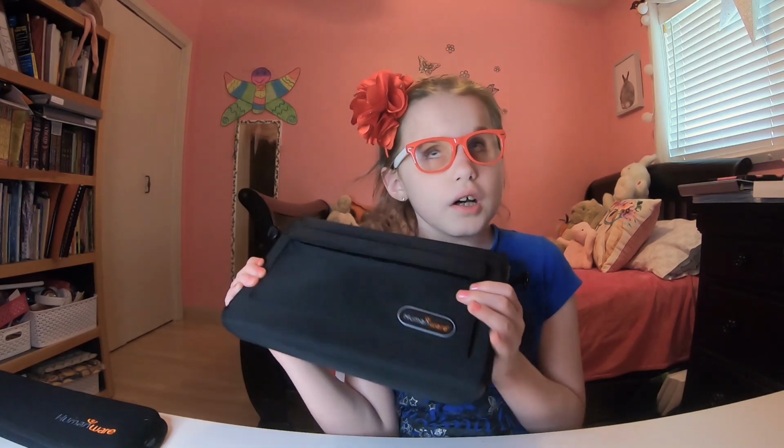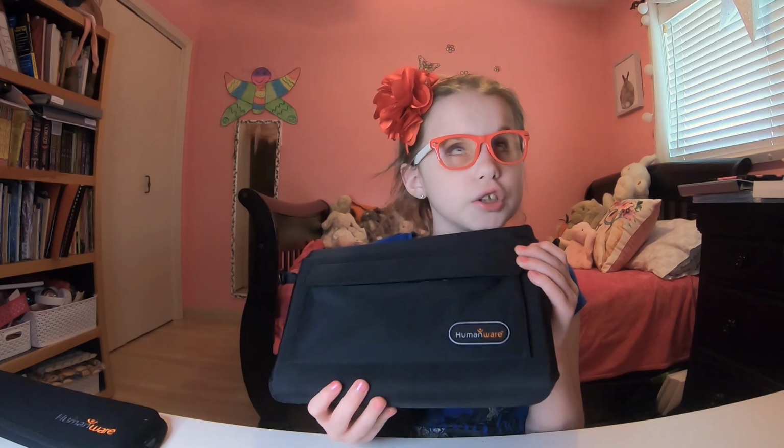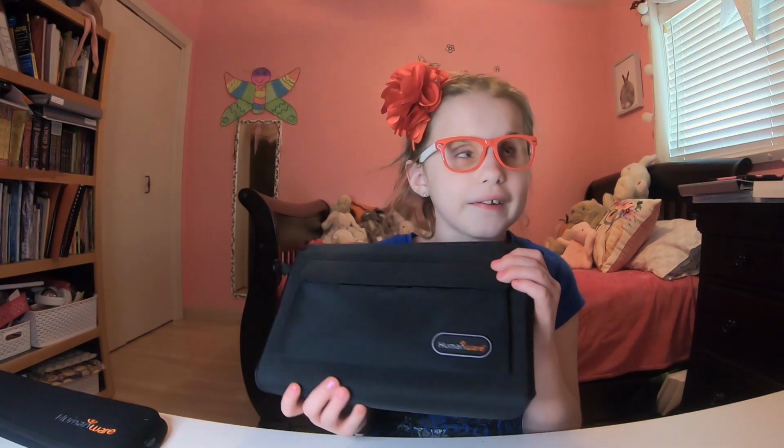On the BrailleNote Touch, you can send emails, and KeyWord is for writing. You can write a journal entry or a story, whatever you want to write. Just put it in KeyWord, then you can emboss it. I'll get to that later in the video.